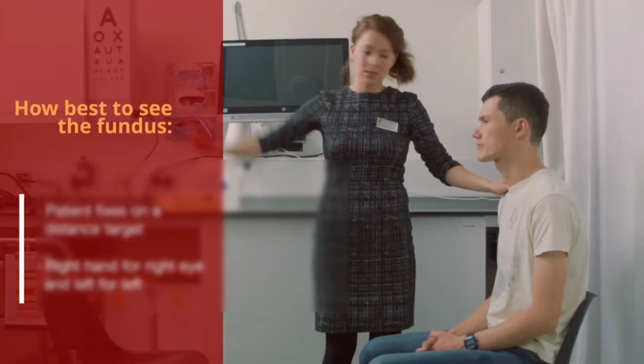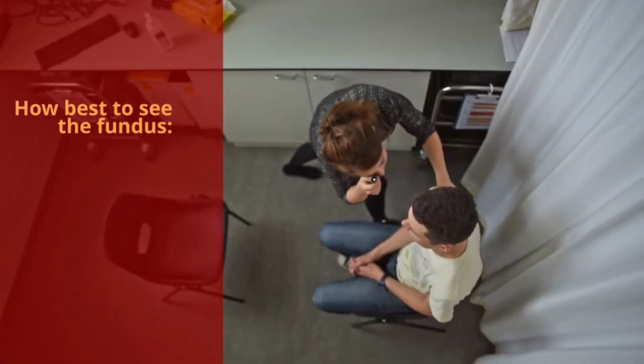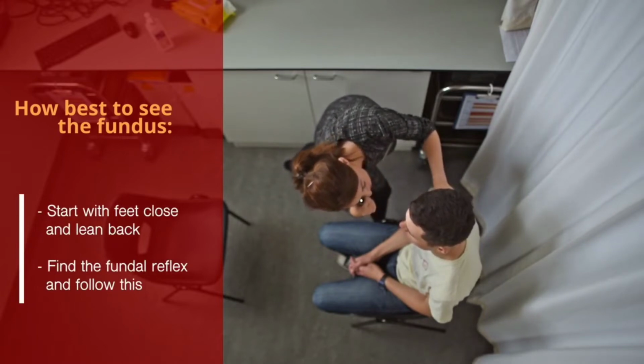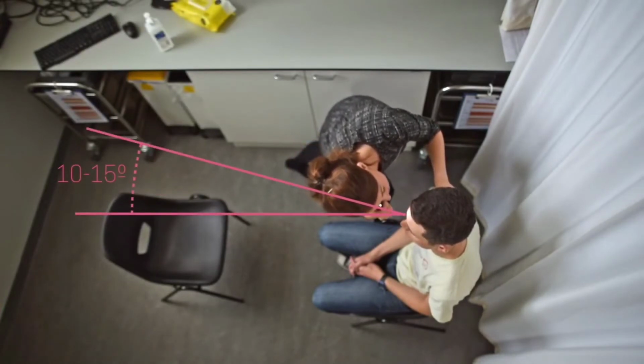Ask the patient to fix on a target in the distance. Use your right hand and right eye to examine their right eye and your left for their left. Start with your feet close to the patient and lean back. Identify the fundal reflex and follow this, moving in on a path 10 to 15 degrees temporal on the horizontal.